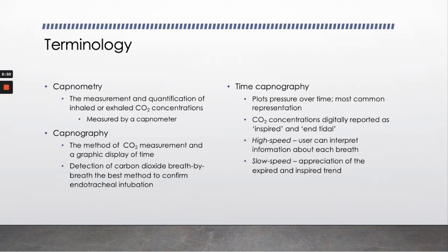Capnography would be the absolute best way to indicate that we have intubated a patient and the tube is in the correct place. Now, however, and we'll talk about the color changing indicators in a couple of slides, those have sensitivity problems.